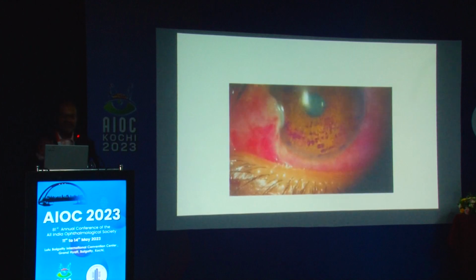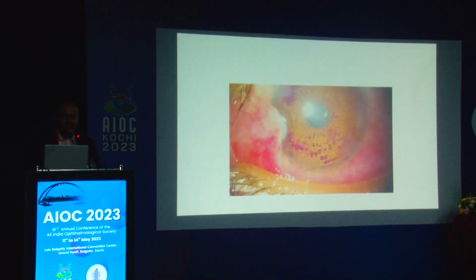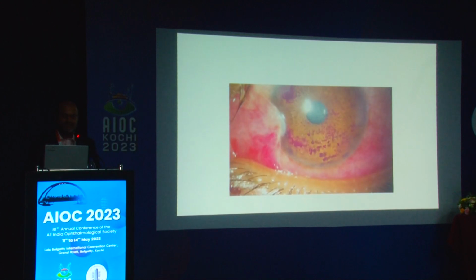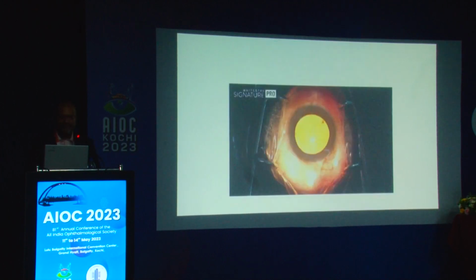They feel very gratified. This lady actually came to us after getting the other eye done 1 year before. She has a science background. She wanted to see the response of the procedure after 1 year. So on the left side is the right eye which we had done 1 year back, and this is the freshly operated eye. She wanted to see the result, and then she wanted to undergo the other. So both the eyes are now off medication.